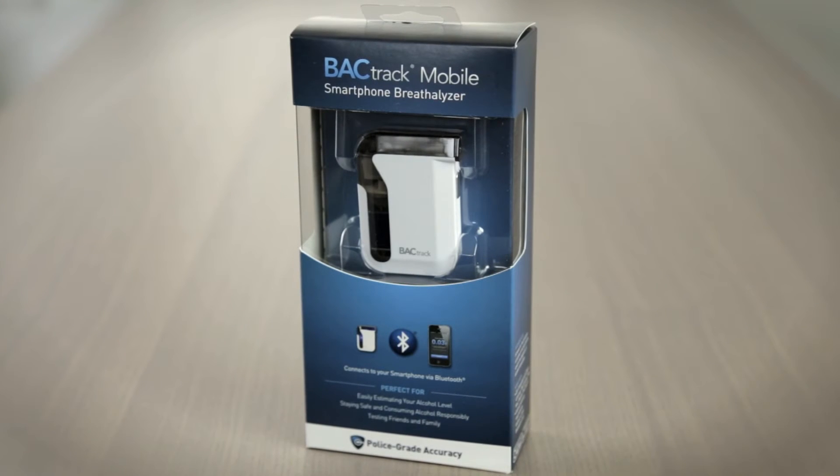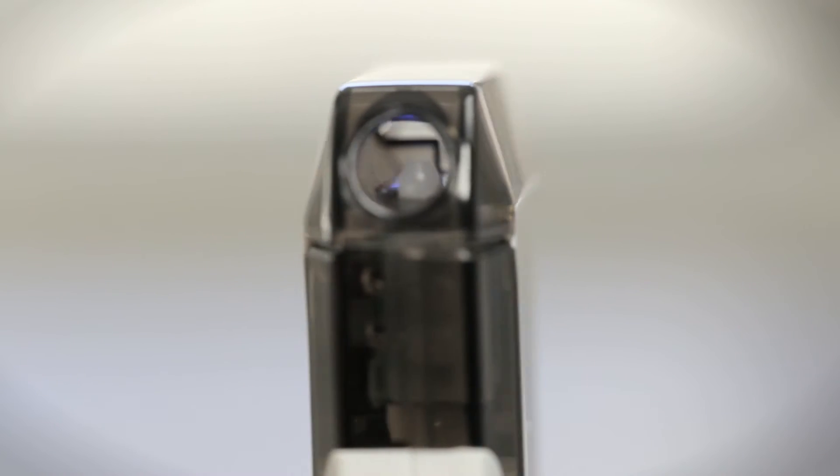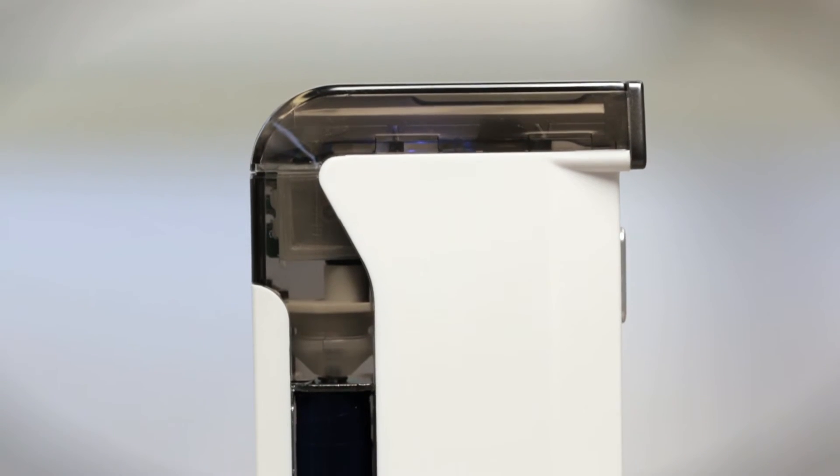Introducing BACtrack's award-winning smartphone breathalyzer, BACtrack Mobile. Featuring BACtrack's police-grade extended fuel cell sensor technology, BACtrack Mobile delivers reliable and accurate BAC results you can trust every time you test.